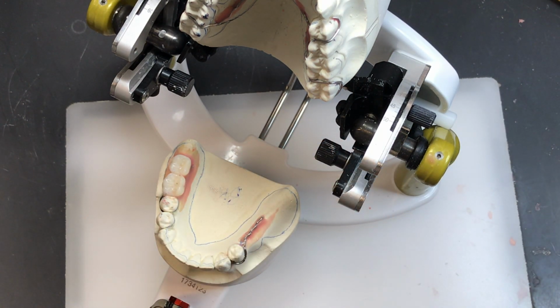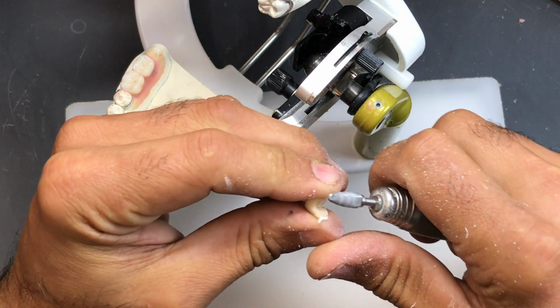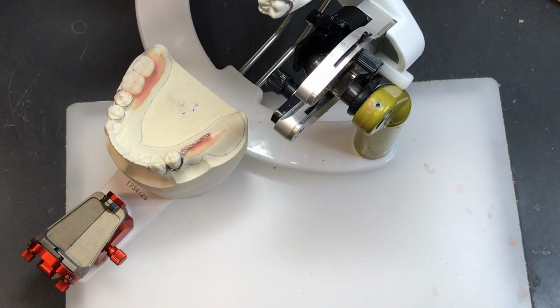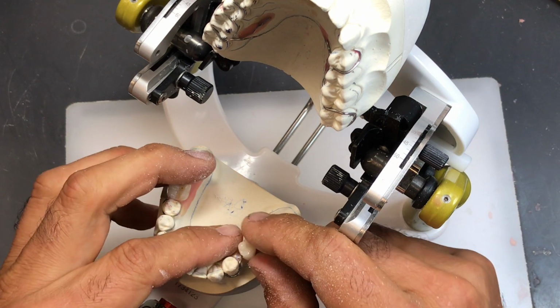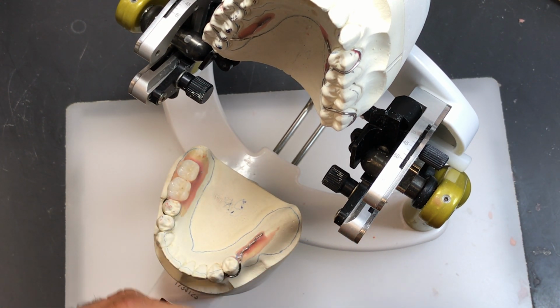And for good measure, even though I don't have to, I'm going to reduce a little bit on the underside of the tooth, just to roughen the tooth anyways. It might be a premature spot right here. I felt like there was one, but let's see if that helps a little bit. Let's see, tentatively hold it into position. Still feel a little interference with a wire right about in here, so I'll switch back to the other burr.